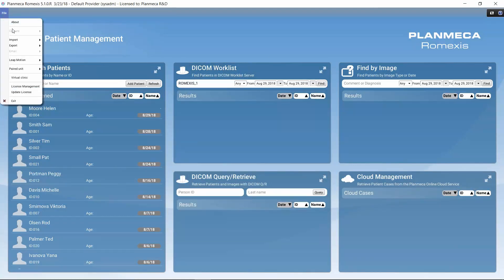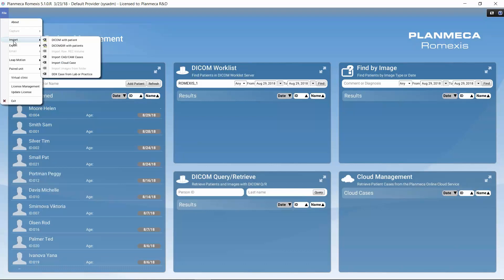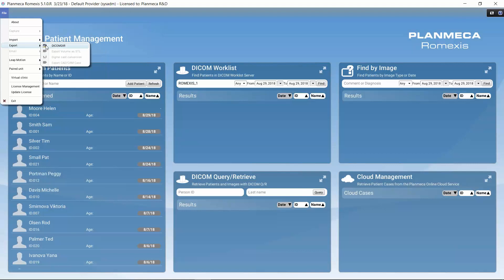There are a couple of other options in the file menu. We can import DICOM or DICOMDIR data with patients and images to Romexis, and we can import CAD/CAM cases. While the imaging modules also have importing and exporting options, here we can additionally export several patients with images in DICOMDIR format.